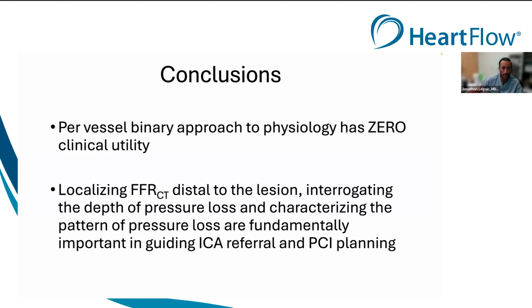My real question is not, is the LAD or the right coronary normal or not? My real question is, will this patient derive benefit from mechanical intervention of that focal lesion? And in order to do that, I need to localize FFRCT distal to the lesion. I need to interrogate the depth of the pressure loss, and I need to characterize the pattern of the pressure loss. All 3 of these elements are fundamentally important in guiding ICA referral and PCI planning, as we've seen now observationally with up to 7-year follow-up and in, again, 2 randomized prospective trials.